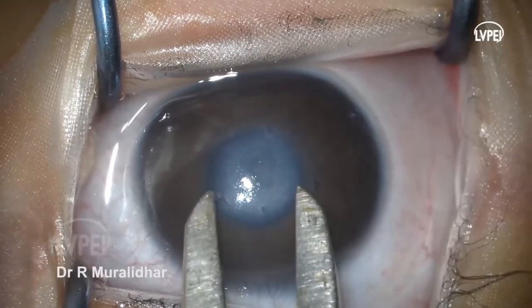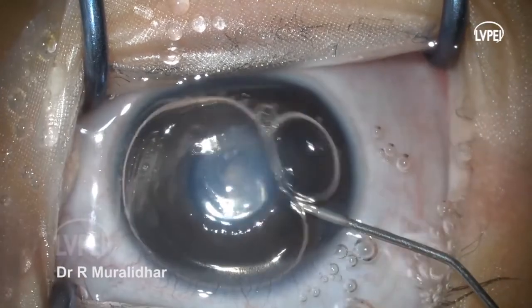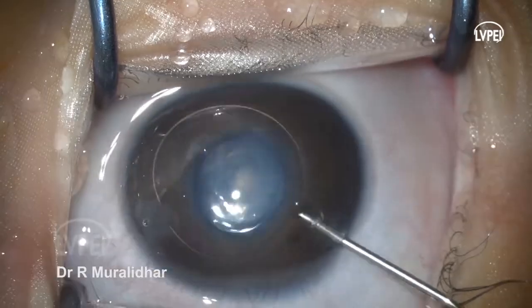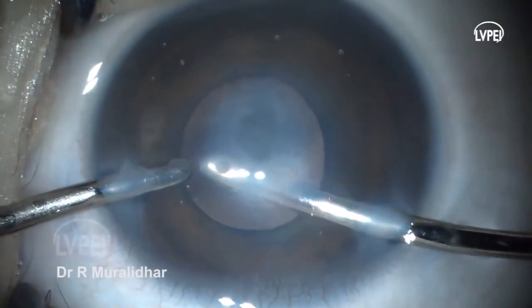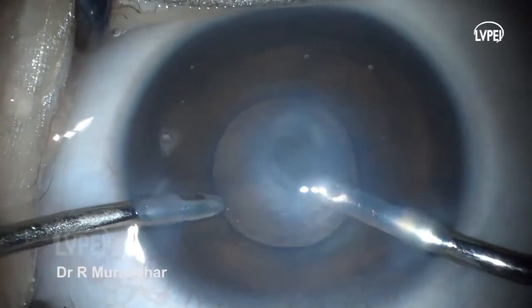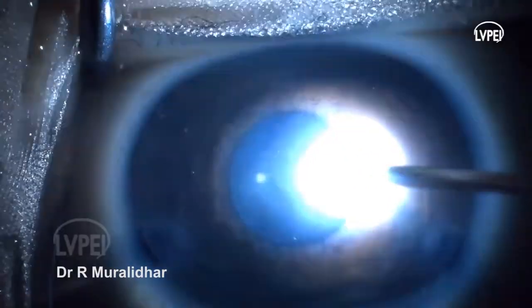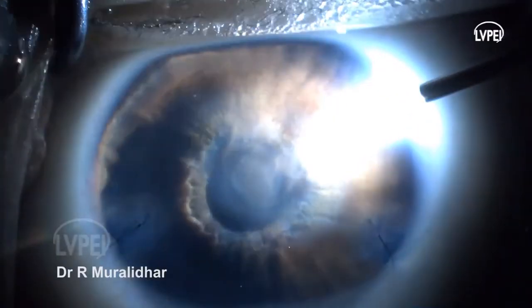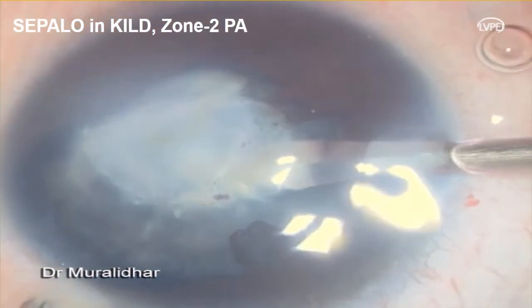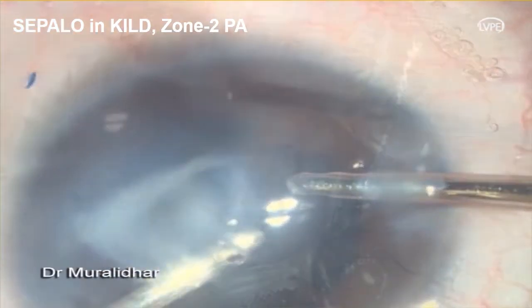This is a technique demonstrating selective endotheliectomy. Step 1, severing the communication between the iris and cornea. Step 2, identifying the actual defect. Third step, delicately removing the anomalous corneal endothelium without disturbing the integrity of Descemet's membrane. Step 4, checking the integrity of Descemet's membrane. There was no Descemet detachment at the end of surgery. In type 2 Peters anomaly, additional lens aspiration along with sphincterotomy was considered in view of a large corneal opacity.